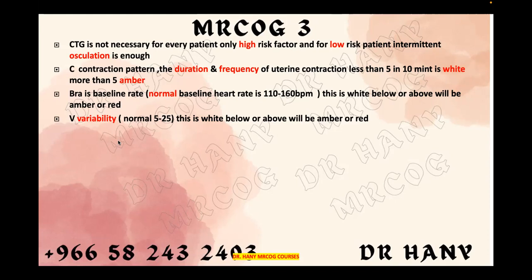So the variability, 25 beats per minute, over 10 minutes only, less than 10 minutes will be amber. This is a change. It was 25 minutes before. And more than 10 minutes, this will be red.